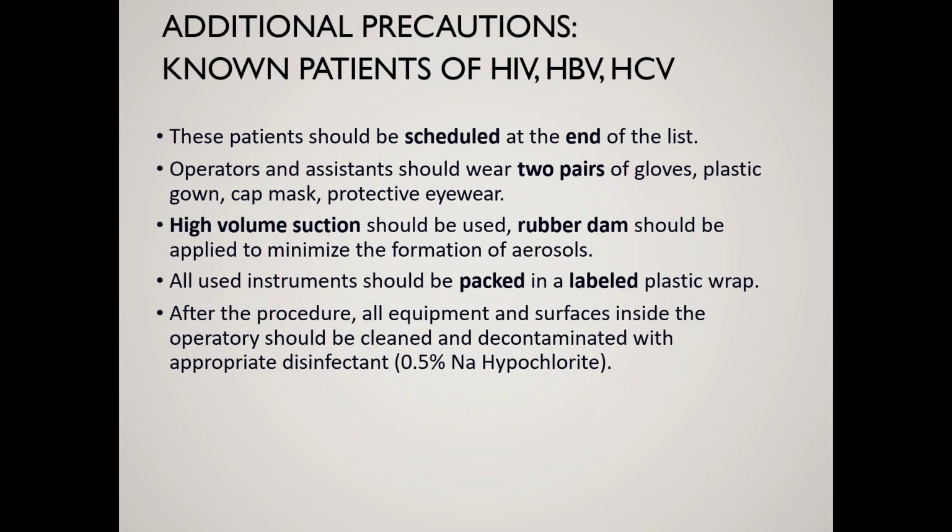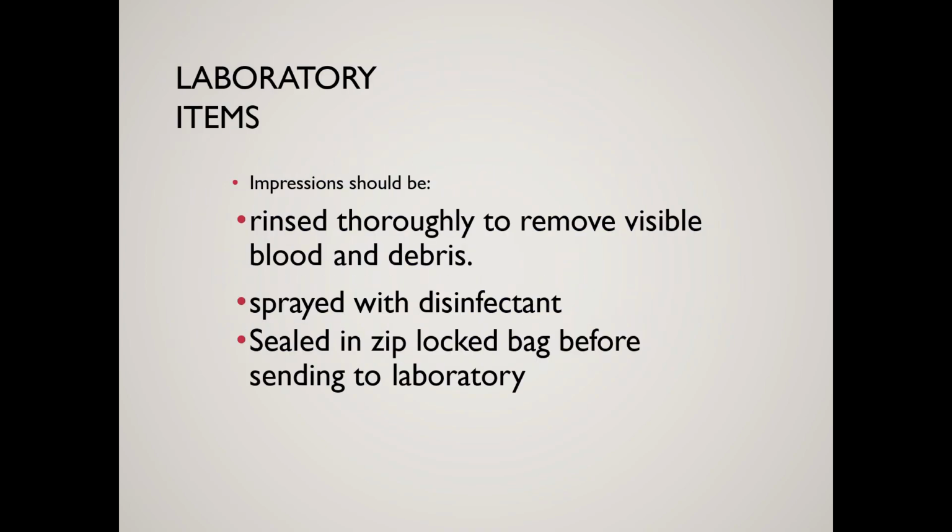Rubber dam should be applied to minimize the formation of aerosols. All used instruments should be packed in a labeled plastic wrap. After the procedure, all equipment and surfaces inside the operatory should be cleaned and decontaminated with an appropriate disinfectant, 0.5% sodium hypochlorite. This is the additional precaution that we have to take for patients involving HIV, HBV, HCV, and TB.